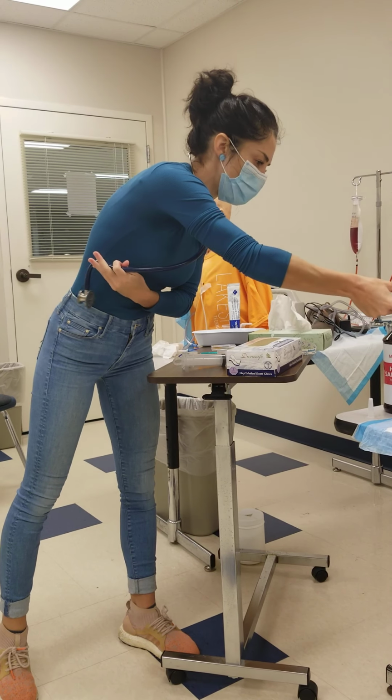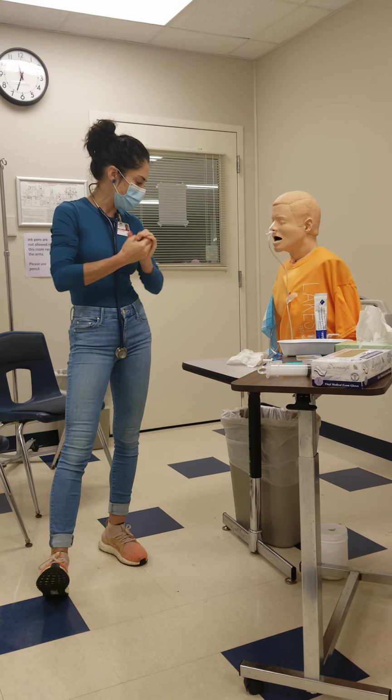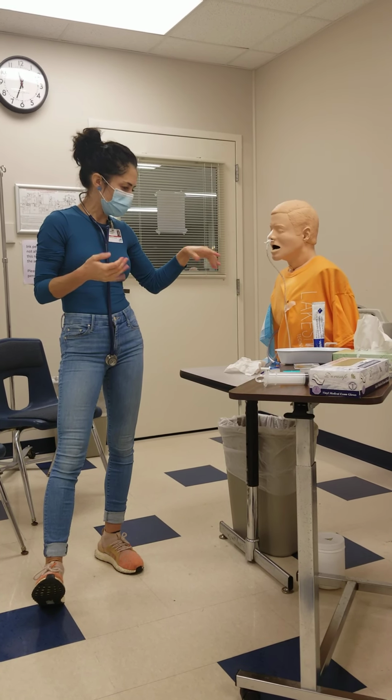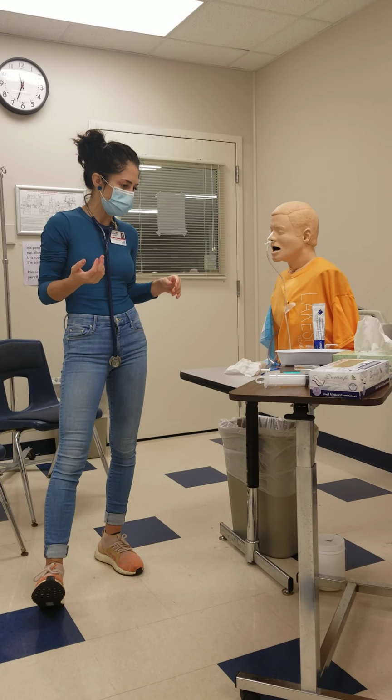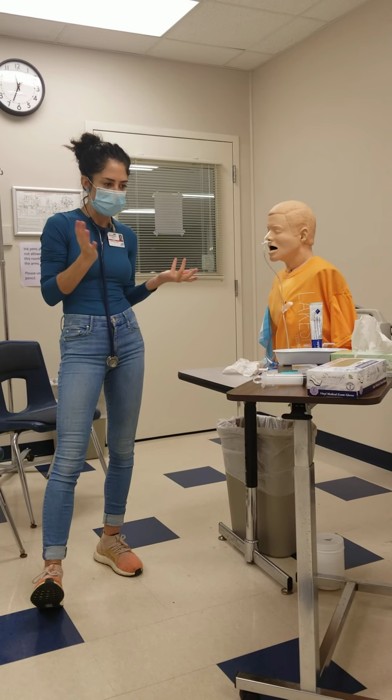I'm going to note the color and consistency of the contents of the stomach, how the patient handled it, what I used, what the pH was, and any other data that I deem necessary.